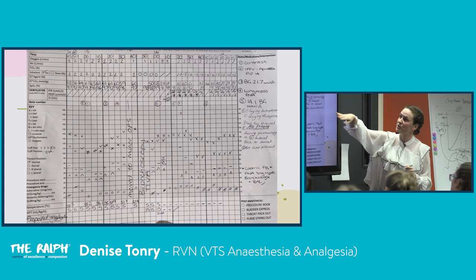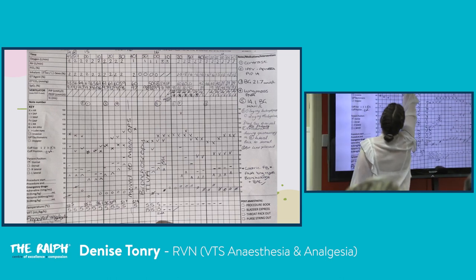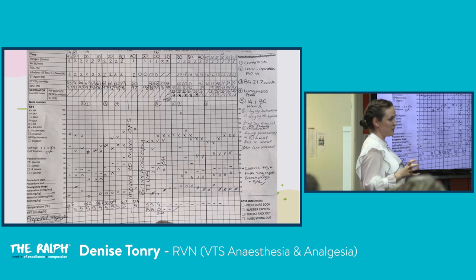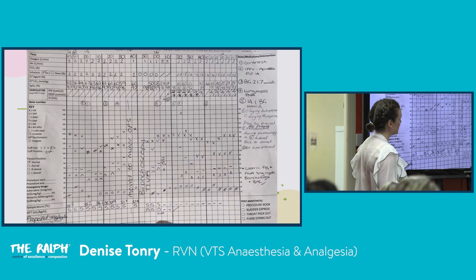All along, her SpO2 is reading fine. Her end-tidal is a bit high. You can see it here: 56, 64, 62, 63. There'll be a question coming up about when we respond to end-tidal, and what types of hypercapnia we tolerate or don't tolerate. I had an inkling that this patient was not ventilating extremely well.